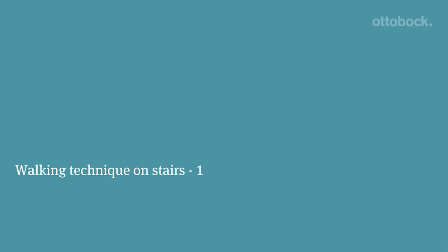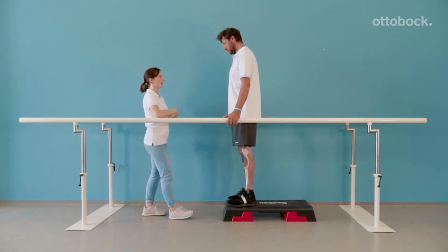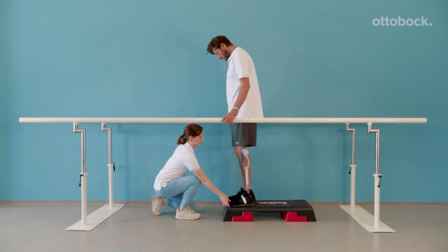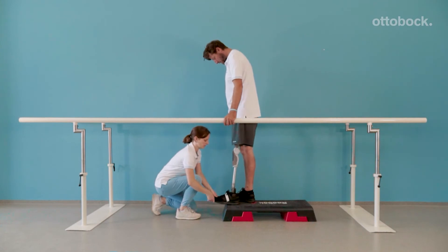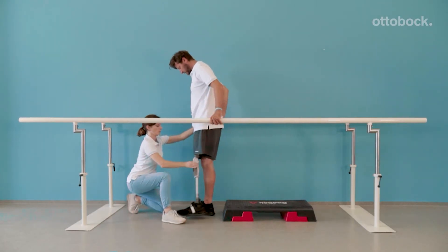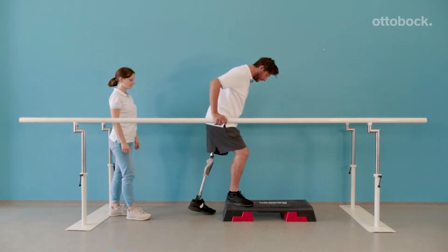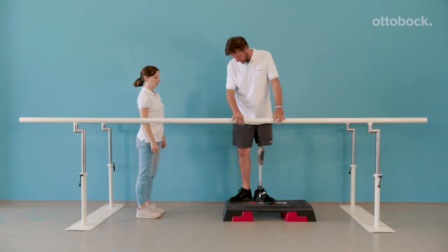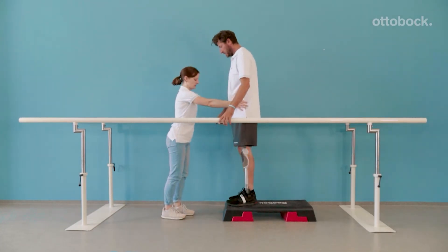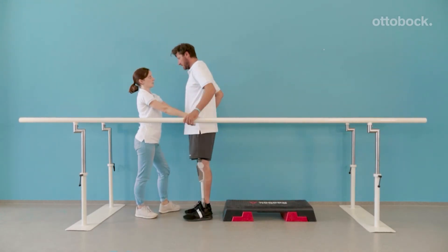Presented here are the basics for walking downstairs. Three main points are crucial for the correct movement: placement of the foot, loading of the prosthesis, and timing of the knee flexion. Depending on the shoe, either the heel or up to a maximum of half of the foot has to be in contact with the stair. With support at the pelvis, the therapist is able to initiate weight shift, control the direction of the movement, and correct deviations of the pelvis.